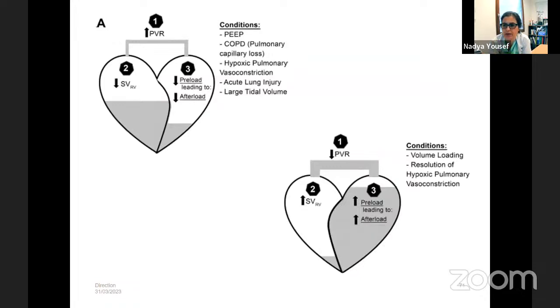And just doing the echo, which many of the intensivists are doing. When I say echo, I don't mean full echo, I mean cardiac POCUS, or for those of us who are more trained, TnECHO. But not looking at the lung doesn't really tell us how our patients are responding to how we're managing them, especially since we also manage them mainly in neonatology for respiratory conditions. I know in my unit, we're extremely aggressive when it comes to non-invasive ventilation, but we don't necessarily always look at the heart to see how the heart would react to what we do. And we're also quite liberal when it comes to increasing mean airway pressures when we're ventilating even the tiniest babies. We don't have many ventilated babies, but the ones we have, we really ventilate.